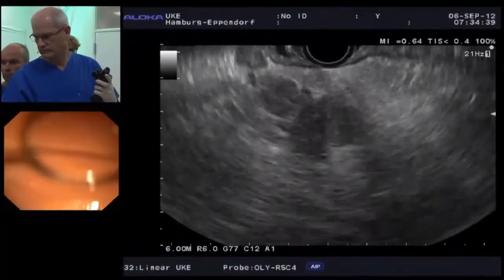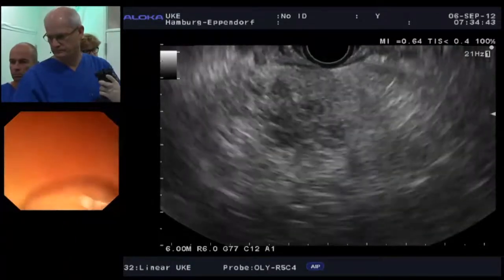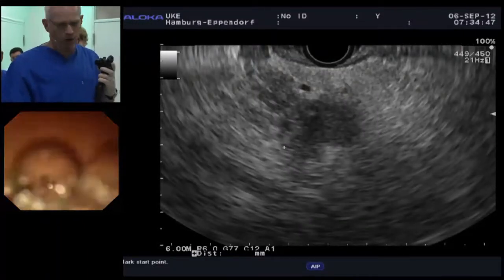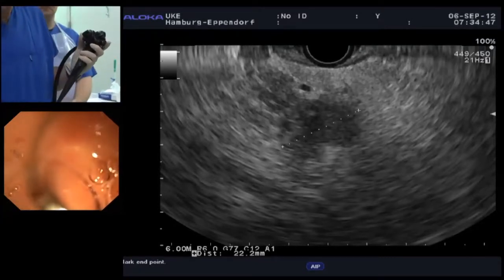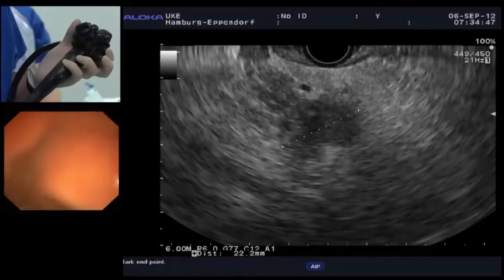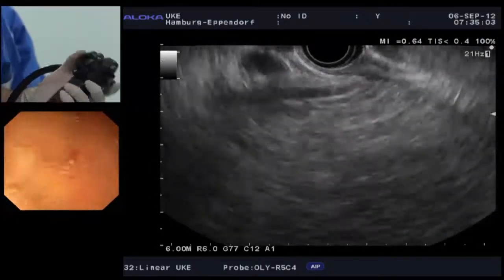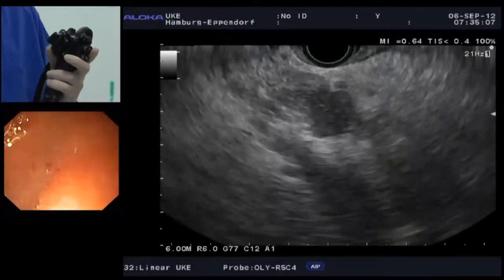I don't know if we have time in this case, but liver lesions are sometimes the easiest to biopsy when present. One other job we have as endosonographers: this patient has back pain, and clearly, or at least what appears to be, unresectable disease. So, Rob, would you consider a celiac neurolysis in such a case? Yeah. Mike, you know the issues of that very well. I think she does have back pain, and that's a bad prognostic sign. She may very well benefit from a celiac neurolysis.